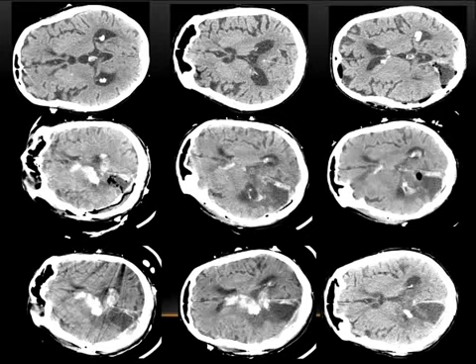The quantum mottle is not what is more offensive; it's things like this. There are some leads here which are shadowing over here. The head is not straight in all of them. All these other parameters matter, to some extent, a lot more than the CTDIvol that was used. I mean, that definitely does matter. Gray-white differentiation is based on that. But all these other extrinsic parameters come into play.